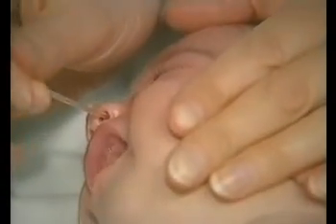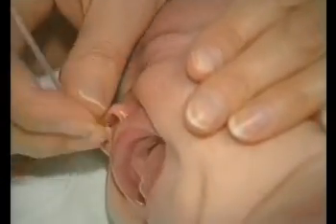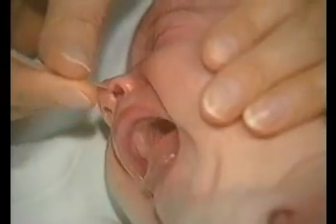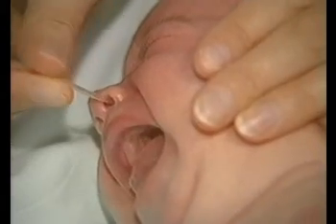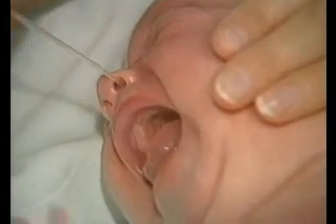The child's nostrils should be cleaned out. And if oxygen is still needed, the catheter should be put back into the other nostril.